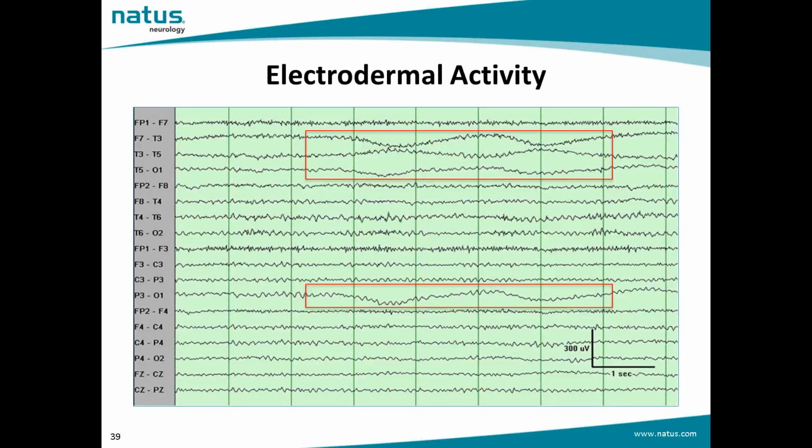The electrodermal activity generates the perspiration artifact that arises from skin change and consists of slow waveforms that are usually greater than 2 seconds in duration. As we can see in the example in the picture, perspiration causes slow shifts in the electrical baseline by slowly changing the electrical contact between the electrode and the skin.